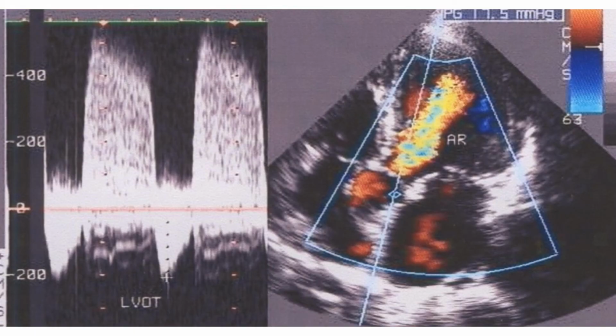The left panel shows a continuous wave Doppler of the aortic regurgitation jet. Below the baseline, forward aortic flow is seen, while above the baseline, the tongue-shaped aortic regurgitation jet is seen. The apical 5-chamber view in the right panel shows a color Doppler image of aortic regurgitation with a wide mosaic jet originating from the closed aortic valve into the left ventricle. From the extent of the AR jet into the left ventricle, it is moderately severe AR.